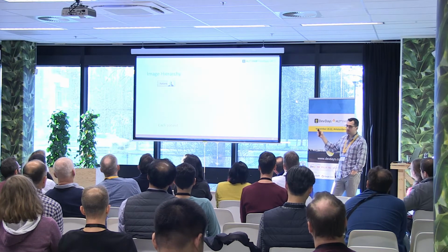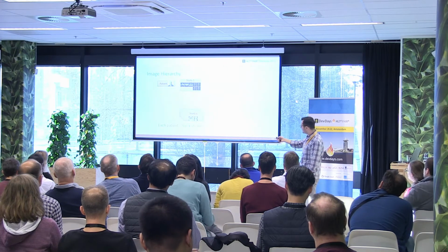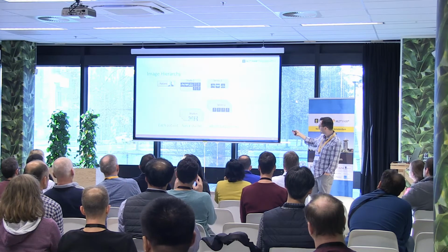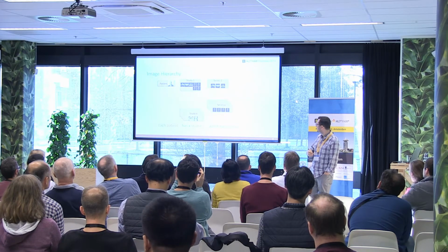Let's very quickly figure out the hierarchy here, what things look like. So at the very top, you have a patient, and a patient can have a number of studies. Okay, within a study, you have a number of series, and then within each series, come on, clicker.